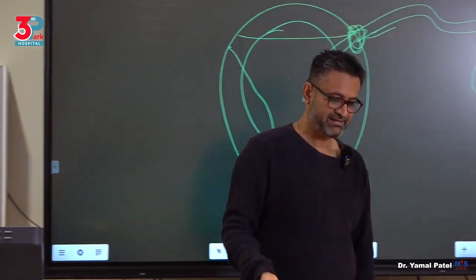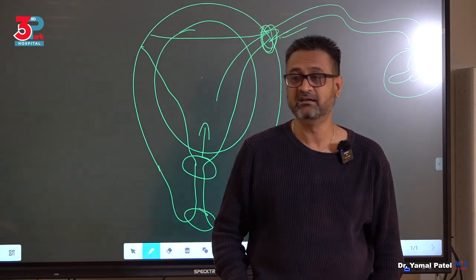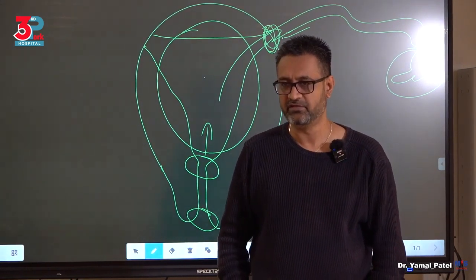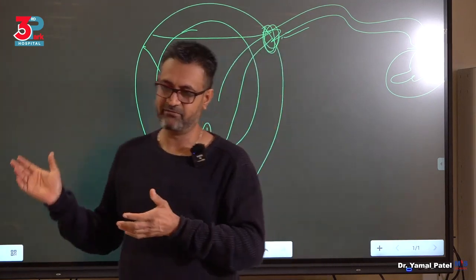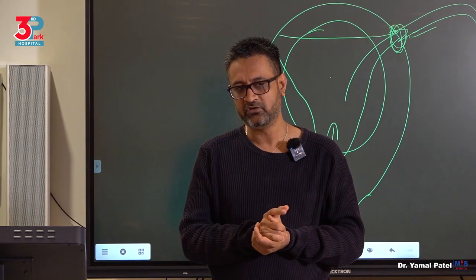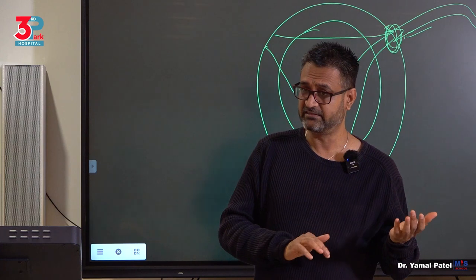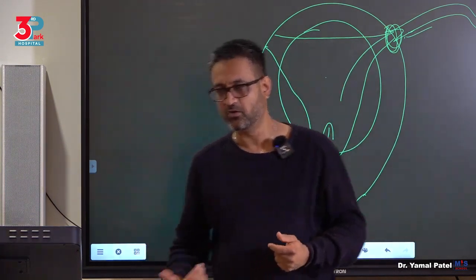So what do I mean by that statement? When we discuss fluid, because fluid is of different types that we could use for distending the media, we'll talk on fluid in a while. So when we talk of fluid, then you're talking of fluid that could either be isotonic, like saline, or could be hypertonic or hypotonic, okay?